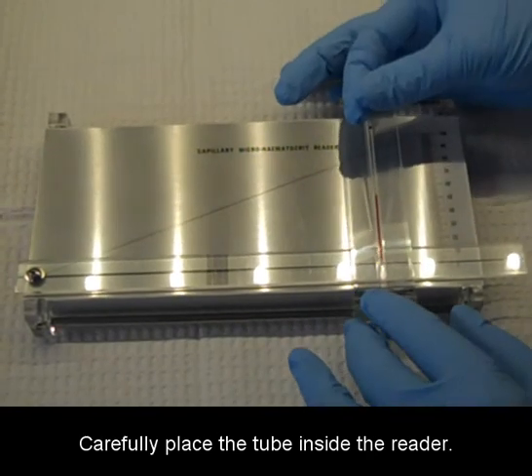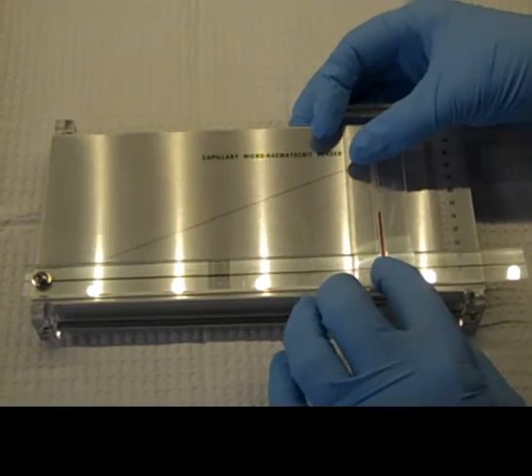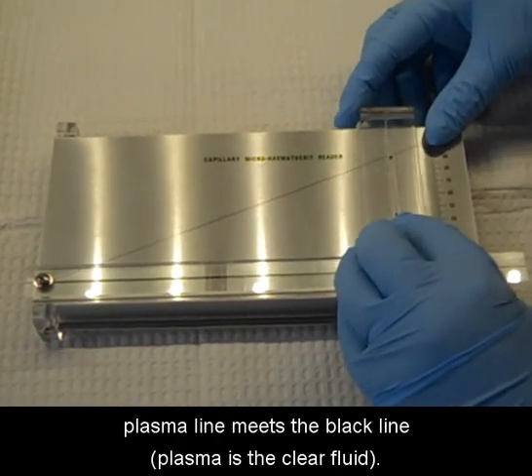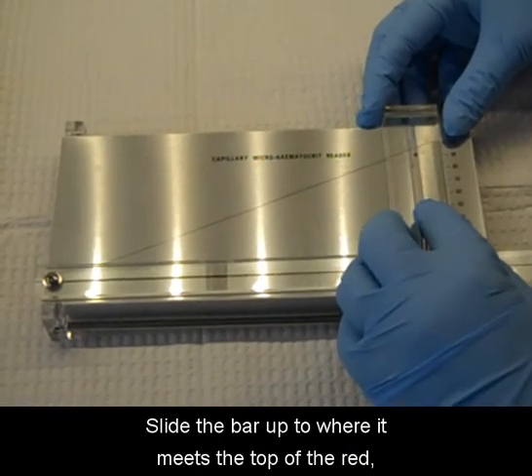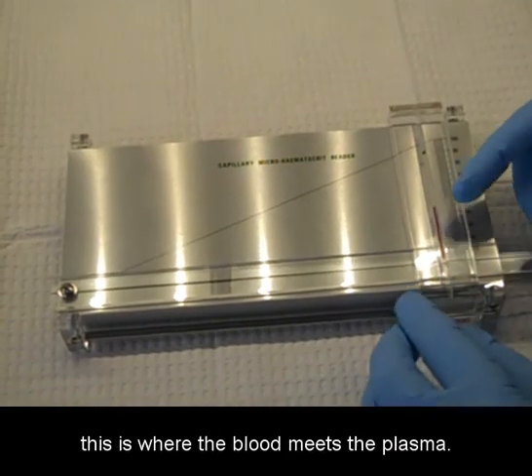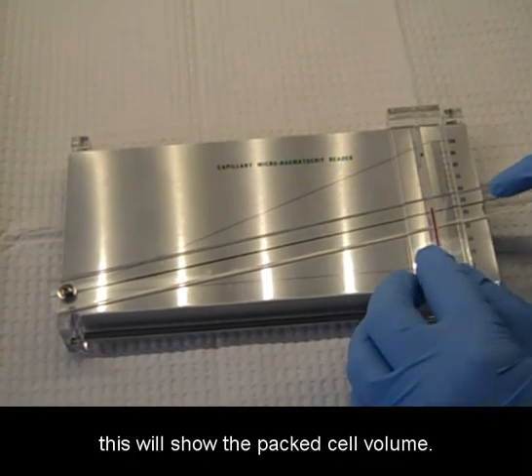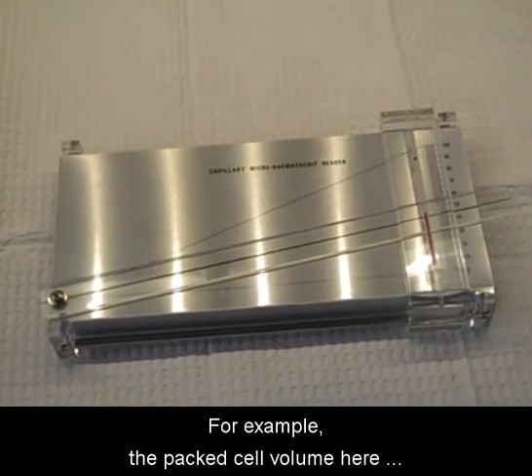Carefully place the tube inside the reader. The bottom of the blood line should meet the zero. Slide the reader to the right so the top of the plasma line meets the black line. Slide the bar up to where it meets the top of the red — this is where the blood meets the plasma. If you read the number to the right, this will show the packed cell volume. For example, the packed cell volume here is 43%.